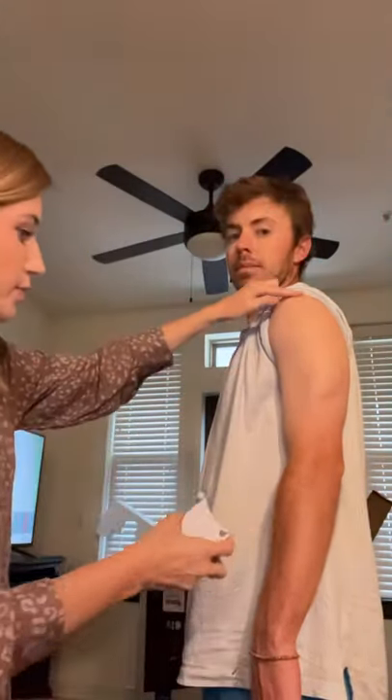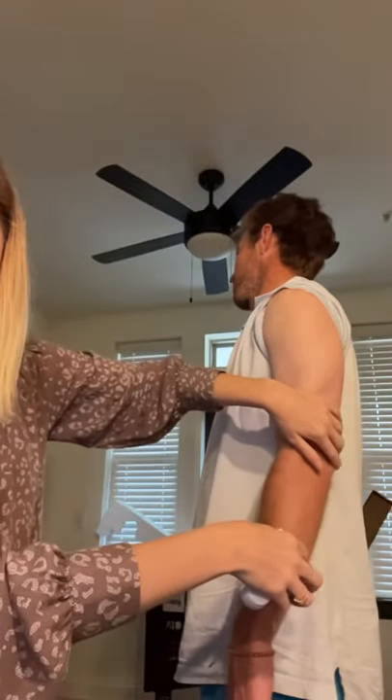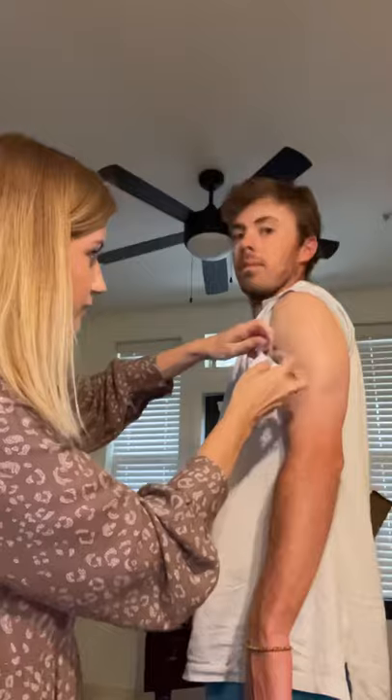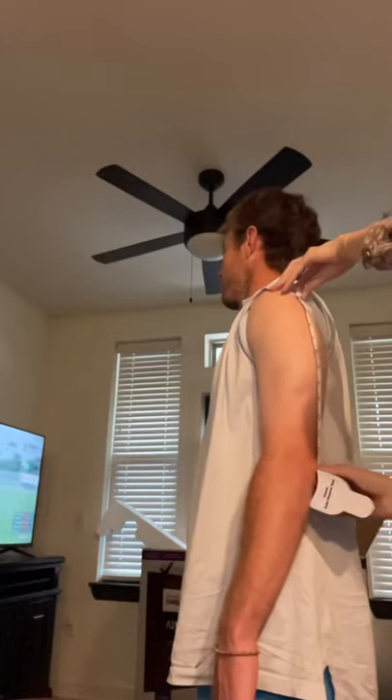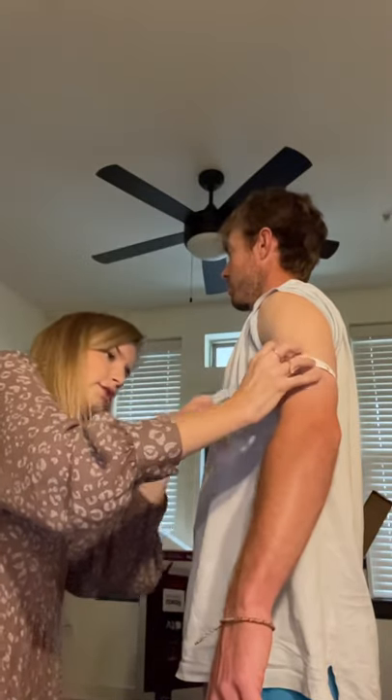Now we're going to do his mid-arm circumference. We're going to find the midpoint between the tip of his shoulder and the tip of his elbow. To be most accurate, I'll figure out where the midpoint is before doing the circumference. That is going to be 13 inches.